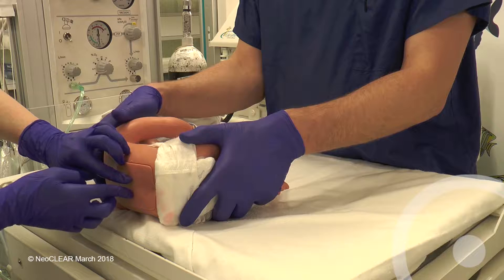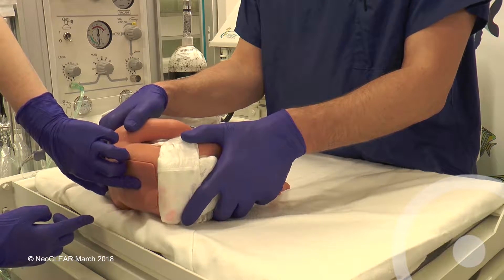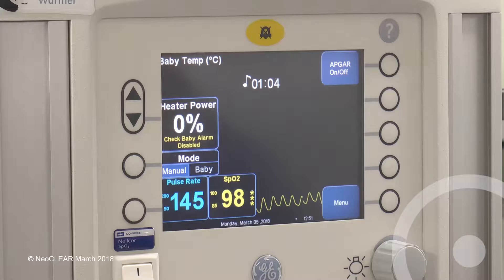Feel for the top of the iliac crest on each side. Just below the intercrestal line should be the L4-5 space. The second assistant should be checking the monitor throughout for the lowest and highest heart rate and for the lowest SATs with a reliable trace.